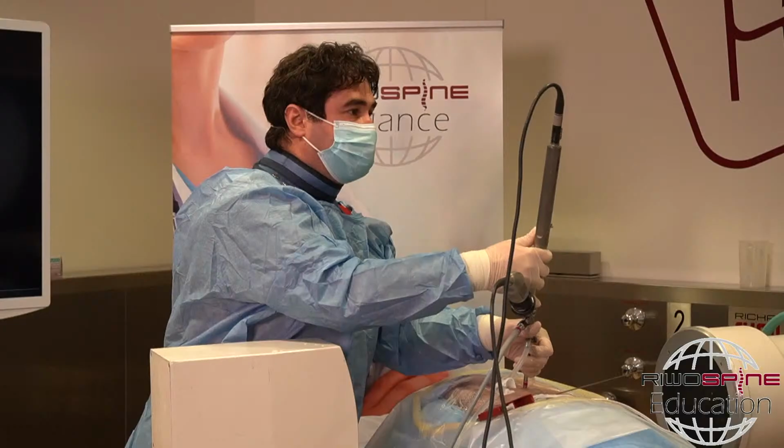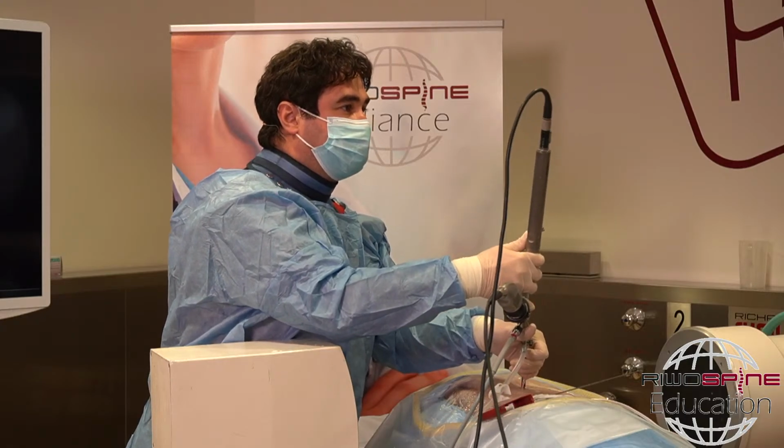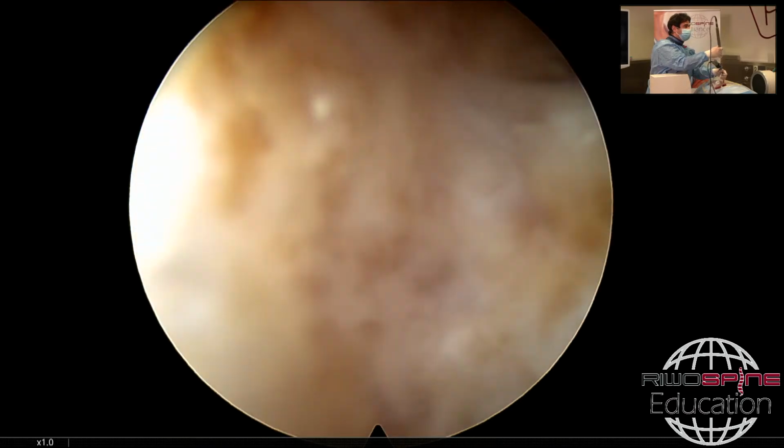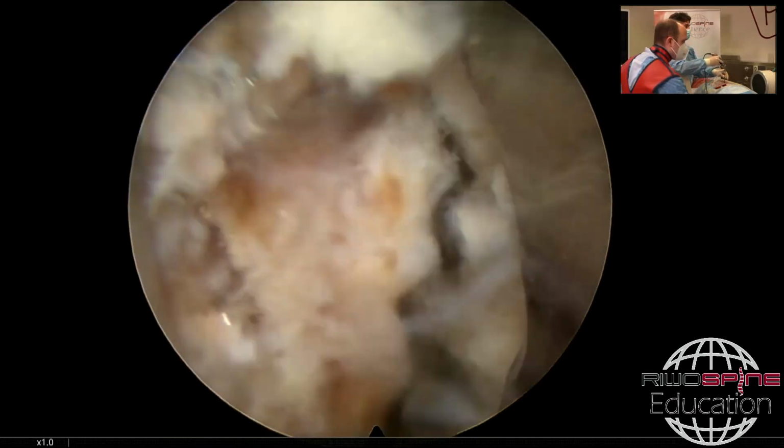I'm on the caudal lamina again. The right side of the picture is the cranial side. The left side, at 9 o'clock, is the caudal. 12 o'clock is the medial side, like in the microscopic view.